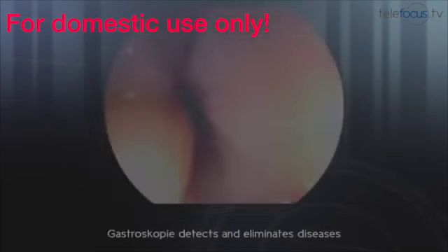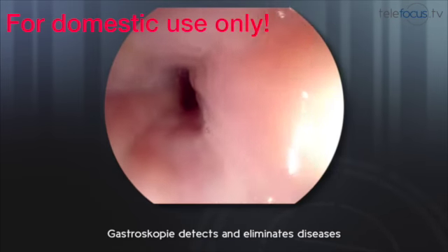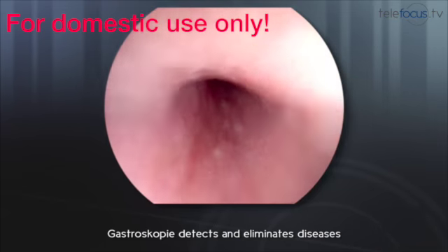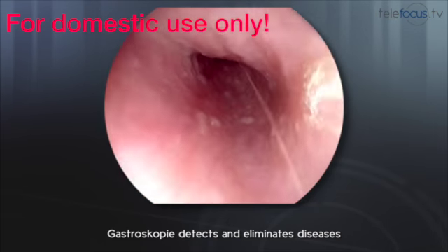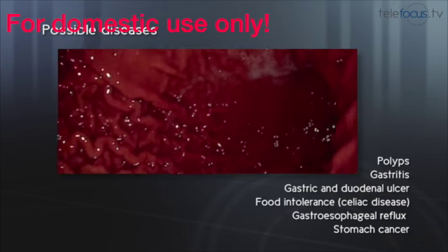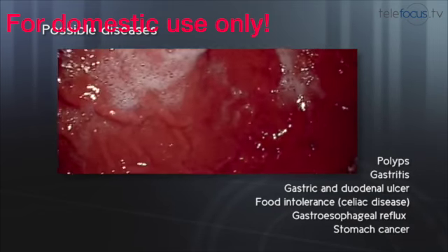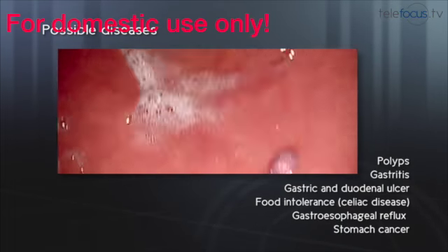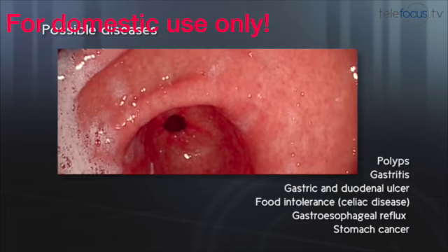The gastroscopist detects pathological conditions of the upper gastrointestinal mucosa, which may often be treated directly. Possible findings can be polyps, gastritis, gastric and duodenal ulcer, food intolerance, gastroesophageal reflux, or stomach cancer.